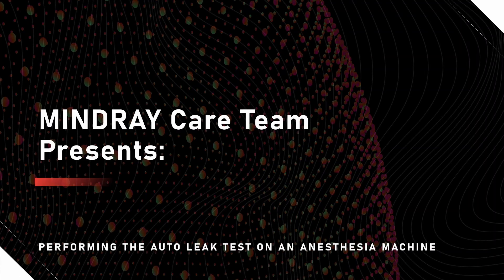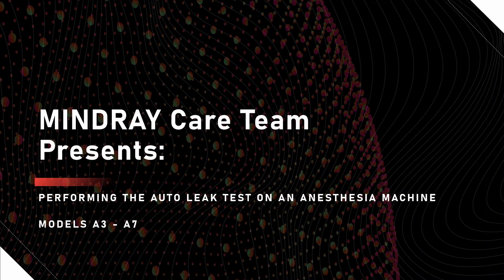Mindray Care Team presents performing the auto leakage test on an anesthesia machine, models A3 through A7.